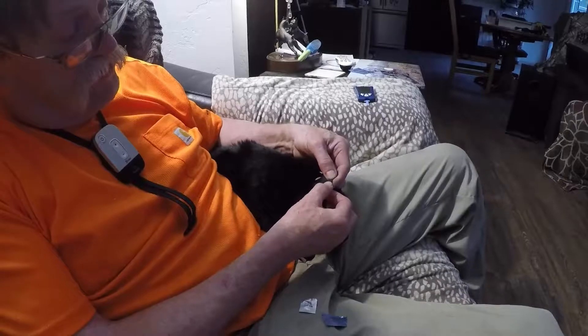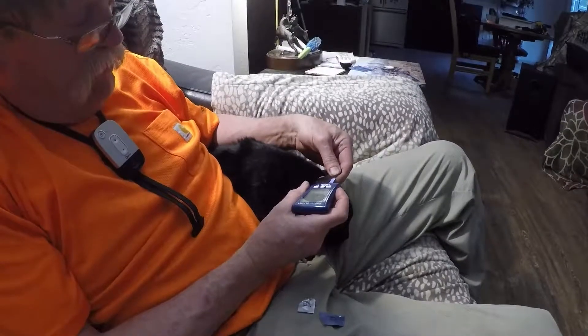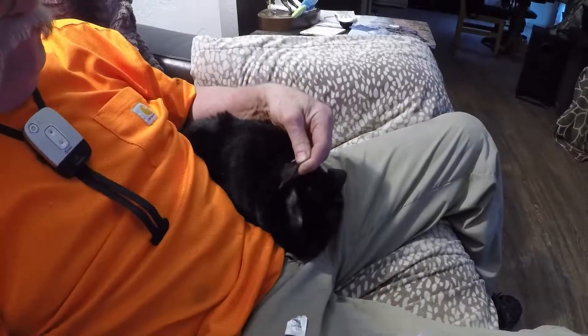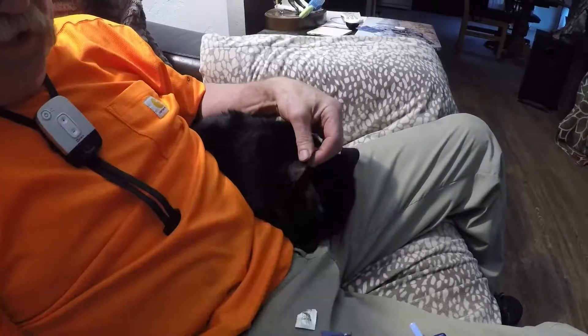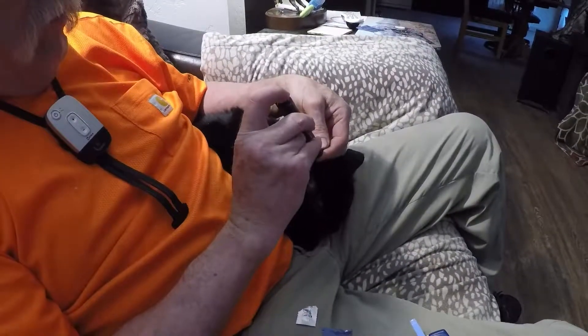The drop of blood is developing there. Take the strip and put it against the drop of blood. You can work the area to get more blood.